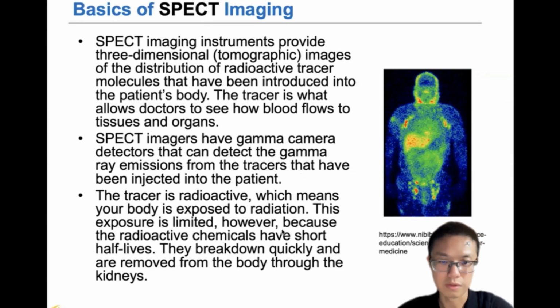And the tracer is radioactive, which means your body is exposed to radiation. However, this exposure is limited, because the radioactive chemicals have short half-lives, and you are given a very tiny dosage of this radioactive tracer.